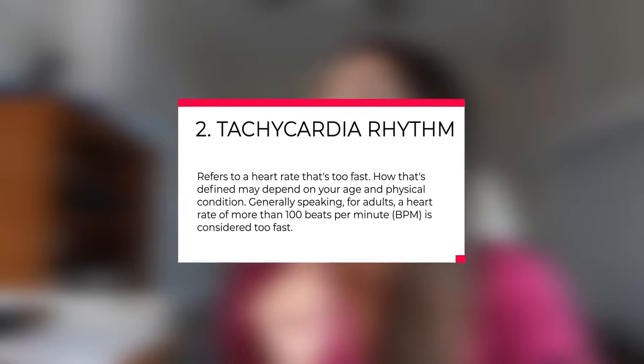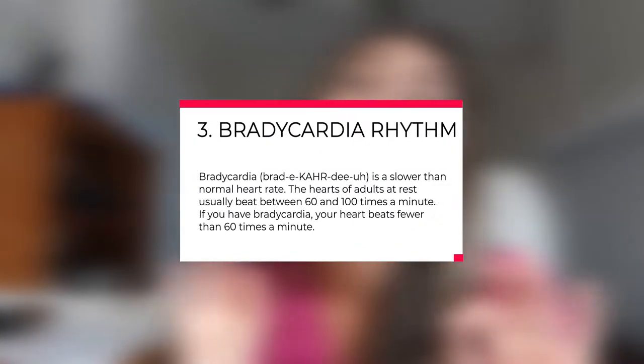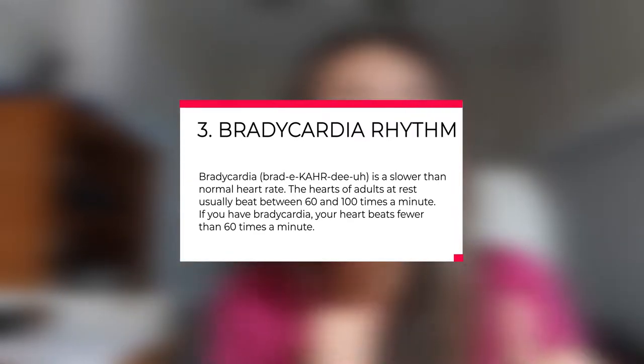Tachycardia. This means that everything looks okay, but the rate is well over 100. Some cardiologists will call tachycardia anything over 120. Textbook is 100. So that is tachycardia. Now bradycardia is everything's working well, but it's super slow. So it's anything less than 60 beats per minute. So remember that 6 second strip, count the R's. Oh shoot, there's only 4 R's. The heart rate's 40, it's a little too slow. So when your heart is beating too slow, you're not getting effectively oxygenated blood to your brain and the rest of the body. And if it's moving too fast, the chambers cannot pump effectively, open and fill correctly. So it can't work effectively either.